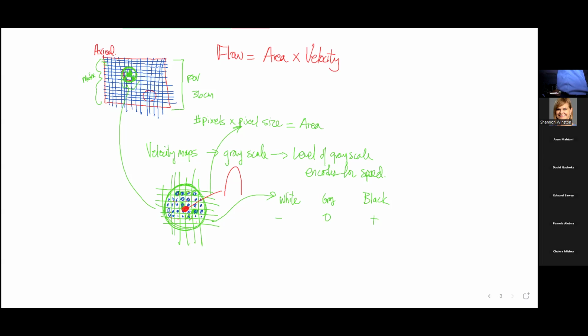And so you get a very true assessment of the velocity across all of the pixels contained within the lumen. So very precisely can you measure velocity, and very precisely can you measure area, and that's how nicely you can get flow. Now, there are, again, more caveats.